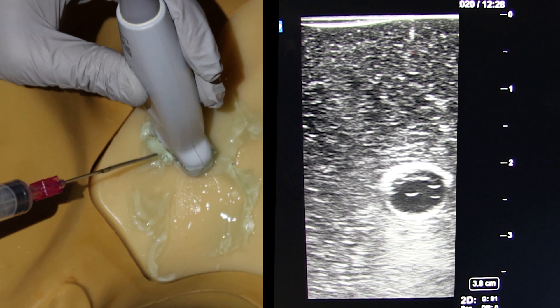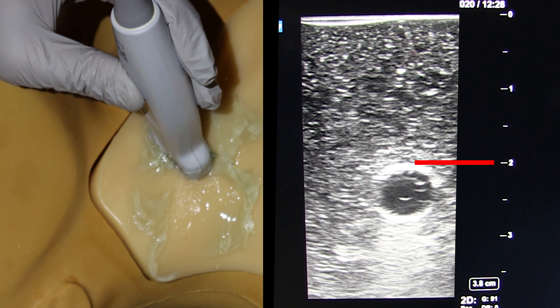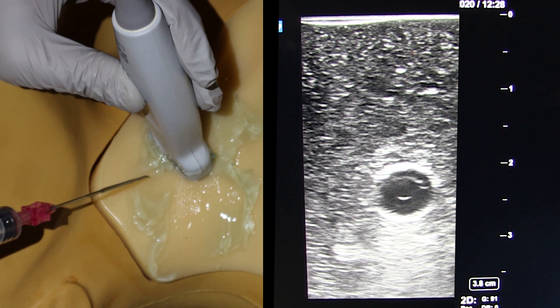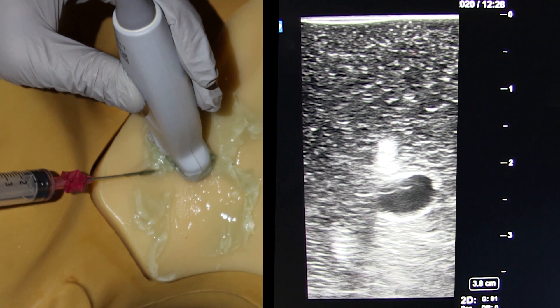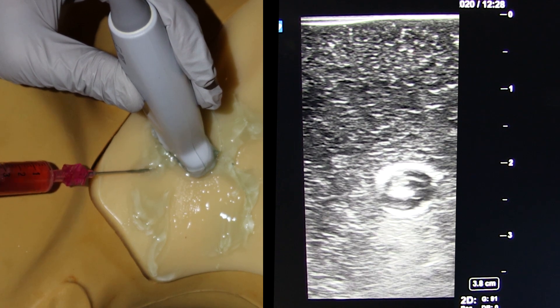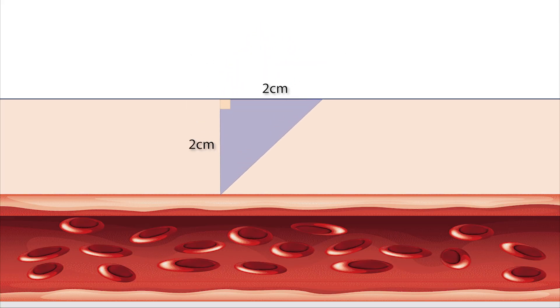The other method is what I call the right isosceles triangle method — you'll see why. Find the vessel with the ultrasound and observe how deep that vessel is from the skin; looks like about two centimeters. Now look at the probe on the skin and estimate that same distance backward from the center of the probe. At that imaginary point, insert the needle at a 45-degree angle from the skin, aiming toward the center of the probe, and slowly advance as you watch the screen. Theoretically, the tip of the needle will come into view at exactly the level of the vessel. This works because a 45-45-90 triangle has equally sized legs — so the depth equals the surface distance.